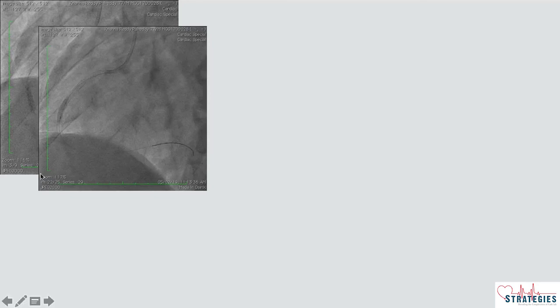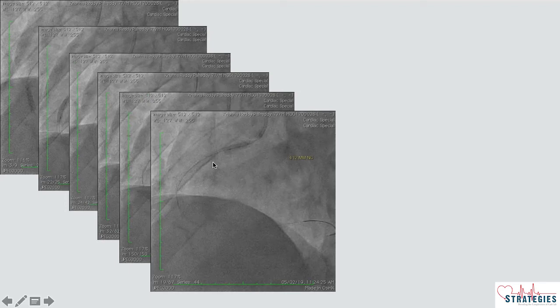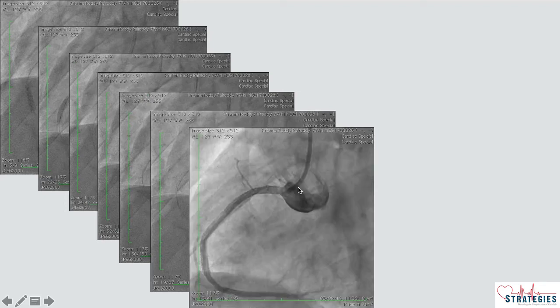So in this case, after post dilatations, we did IVUS and re-expanded the under-expanded areas, and then I gave one injection. This injection is basically to understand any distal wire-induced perforations. Otherwise, if you are sure about your wire position and wire movement, there is no need to give even a final injection. But in my practice, almost always I give only one injection, the final injection, which may take 3 to 4 ml.